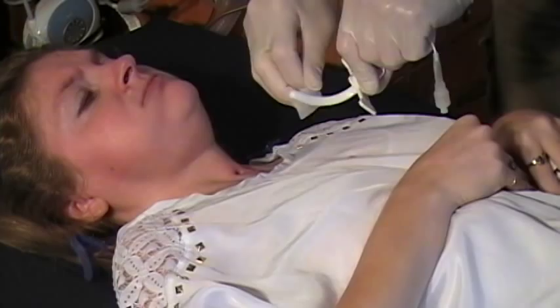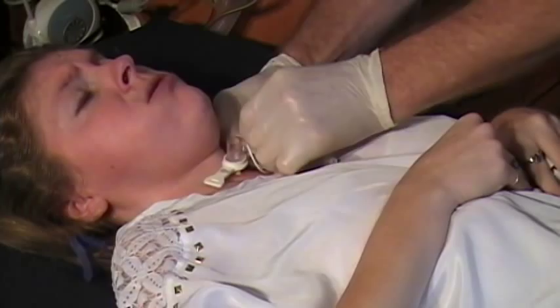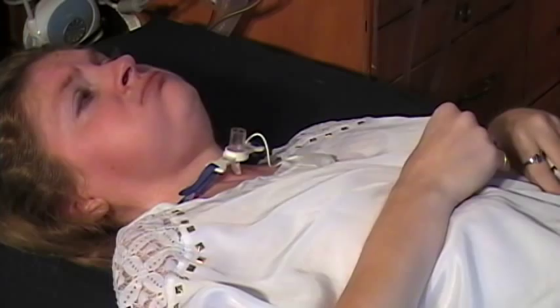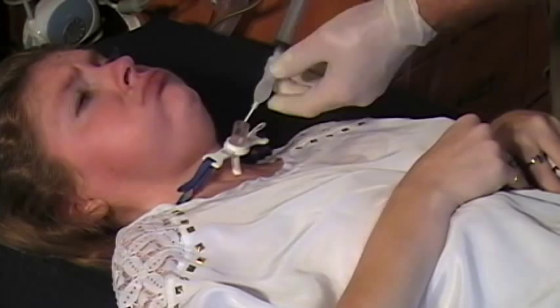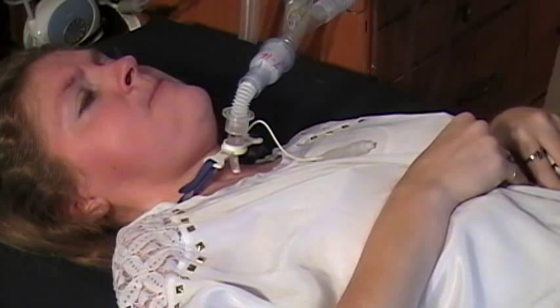I can see on Tessa's face that she's running out of air. You introduce the tube, secure the collar, get her hair out of the way. You get the syringe and inflate the cuff — I pulled the tube out just a little bit because I've learned exactly where Tessa likes it when the cuff is inflated. And then you reconnect the ventilator, and you can see that all this stimulates the cough reflex naturally.